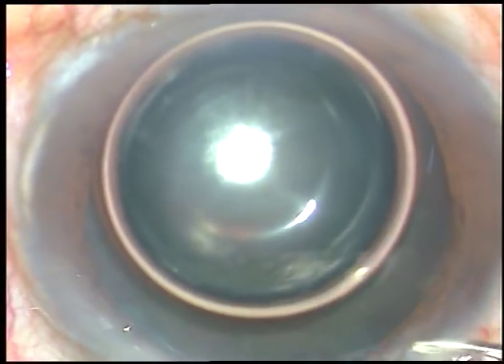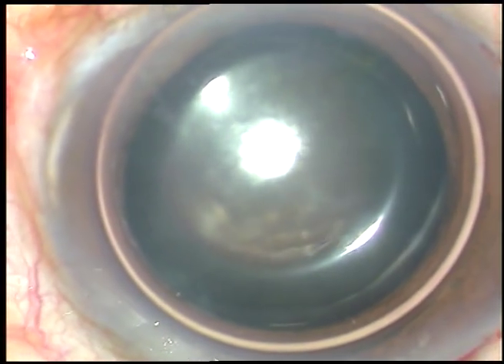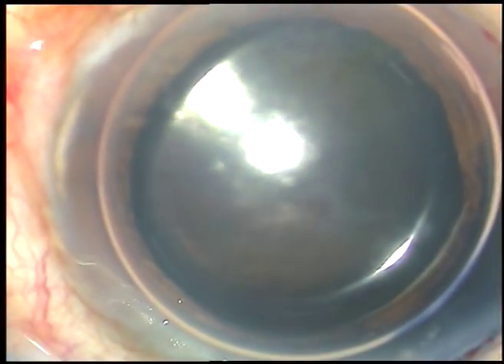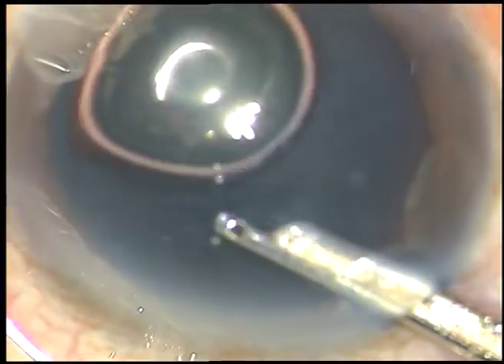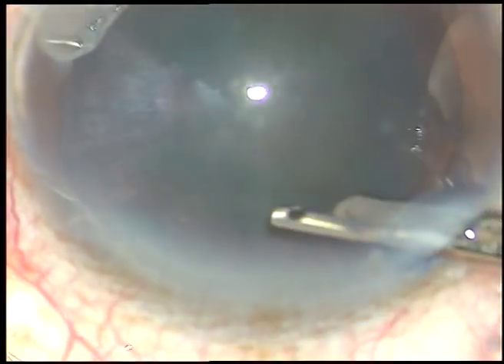In this case I'm going to stain the anterior capsule with trypan blue dye so that I can demonstrate capsular rhexis clearly. The dye has been applied and is washed out after five to six seconds — it's not needed to wait longer than that.